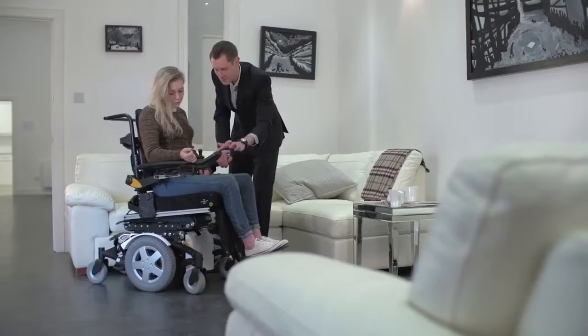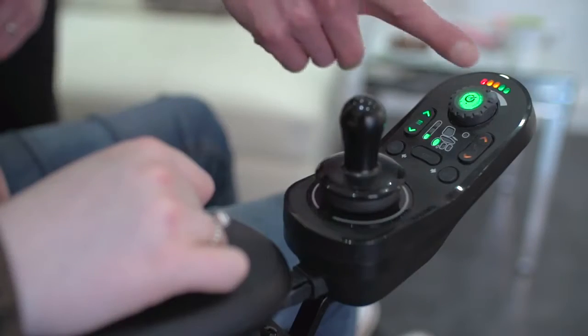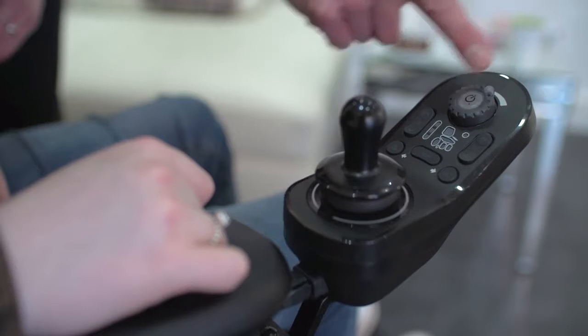This mechanical speedpot is easy to change for all users, even those with limited or fine hand control. The speedpot is also clearly visible at power-up, so avoids anxiety for users who are worried about the initial power chair speed.